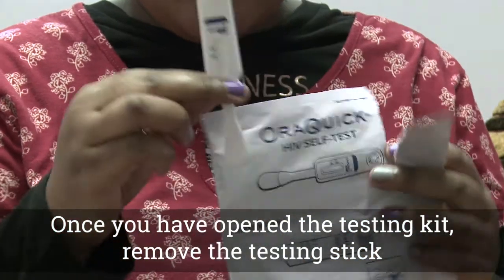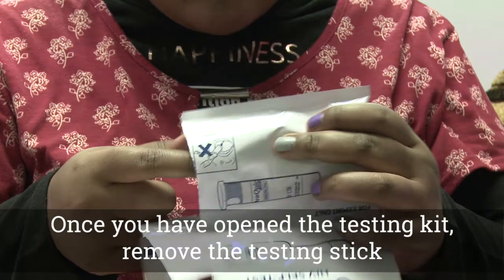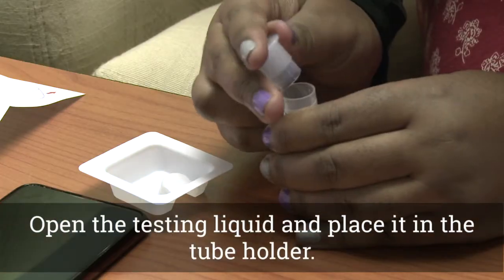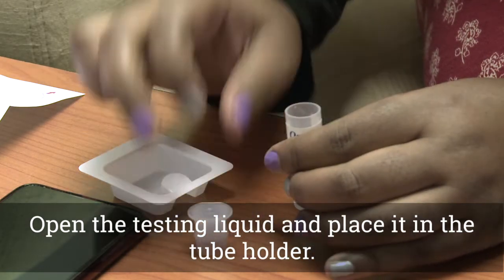Once you have opened the testing kit, remove the testing stick and the testing liquid and place them on a flat surface. Open the testing liquid and place it in the tube holder.